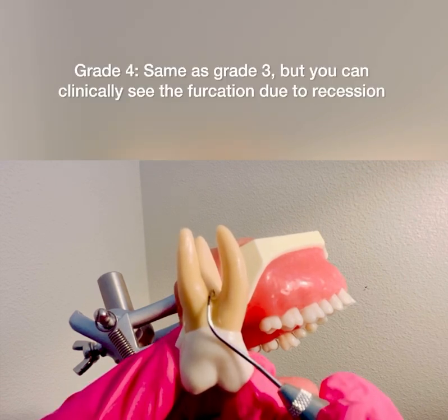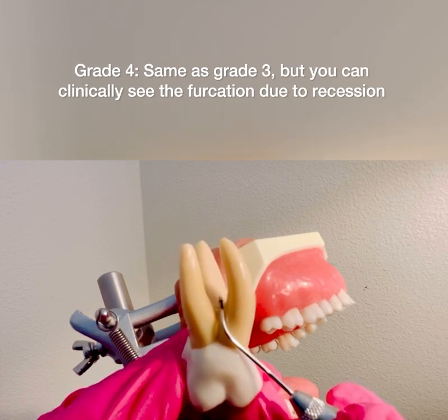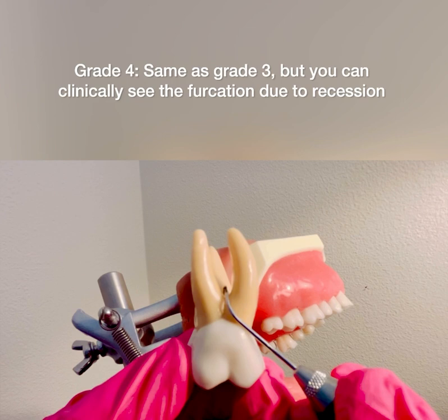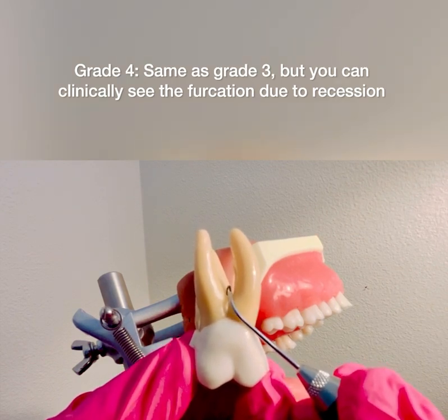A grade four furcation would be that I can continue feeling the palatal probe passing all the way through the furcation, and I can clinically see the furcation involvement — meaning the patient does have recession — that would be a grade four.